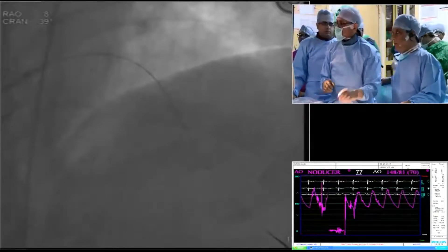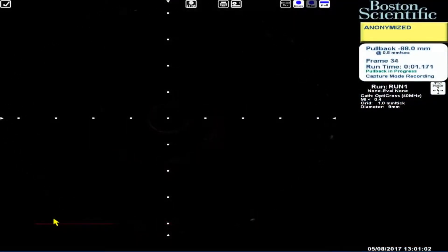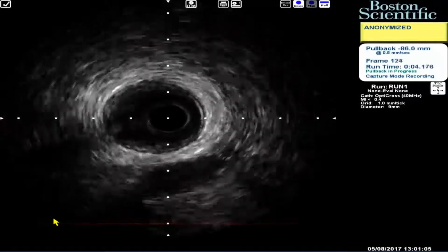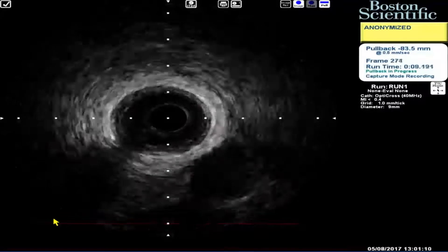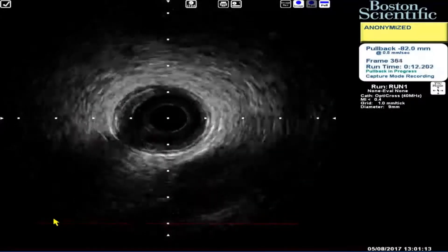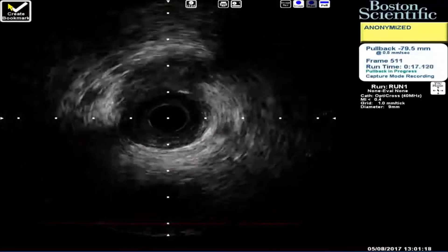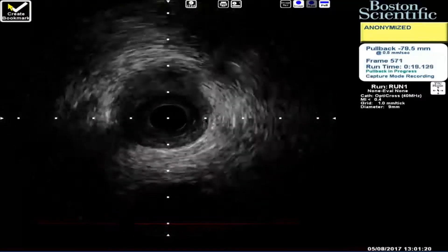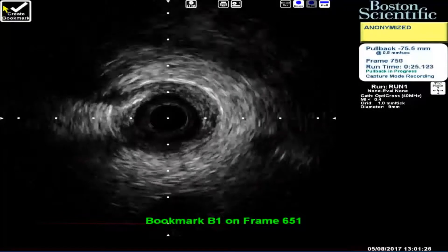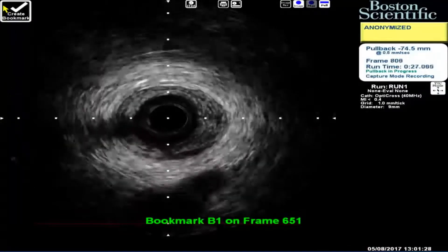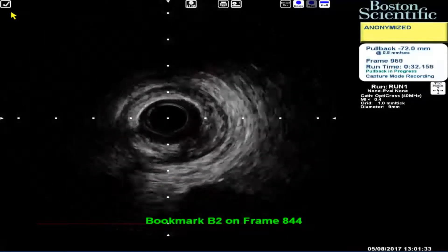IVUS is being shown. Starting. This is distal to the lesion. Very little — no calcium.